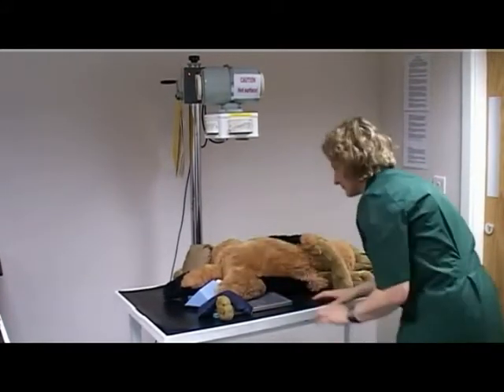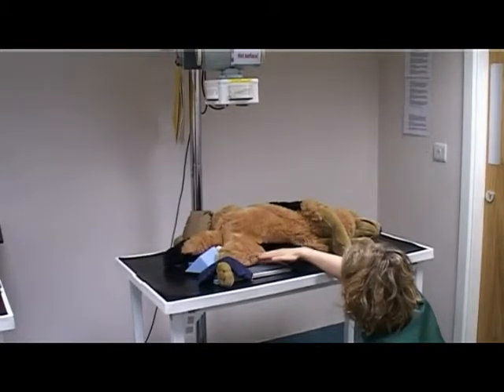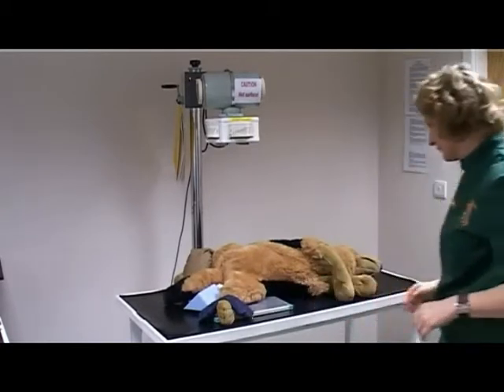Line the tube head up so that the primary beam is positioned over the tibia and fibula region and within the edges of the cassette. Centre the primary beam on the mid-tibia and fibula. Collimate distally to include the tarsal joint, proximally to include the stifle joint, and cranially to include the skin surfaces.